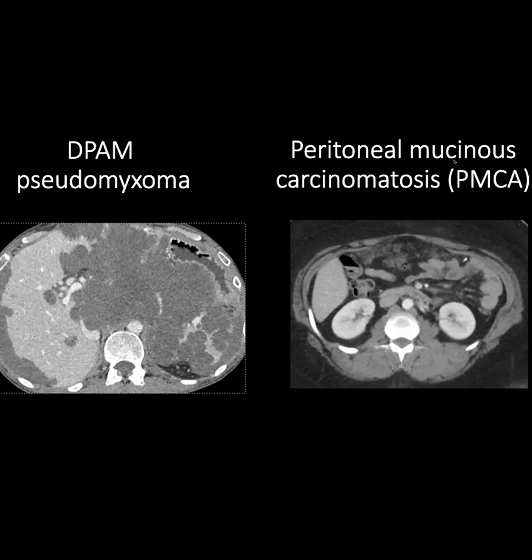Whereas this peritoneal mucinous carcinomatosis from an actual adenocarcinoma causes this more nodular peritoneal carcinomatosis rather than this fluid-filled one. And then these patients do much worse. Now I understand, Aarti, why you're asking me about the differentiation of calling that a mucocele up front.